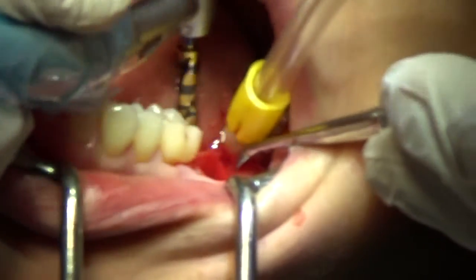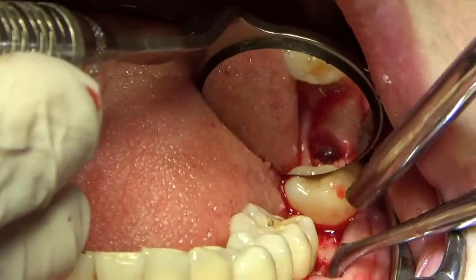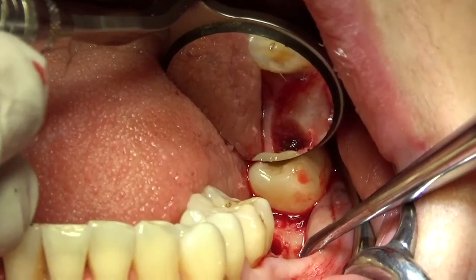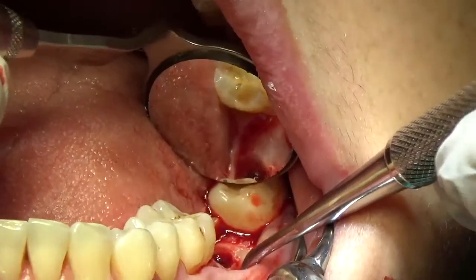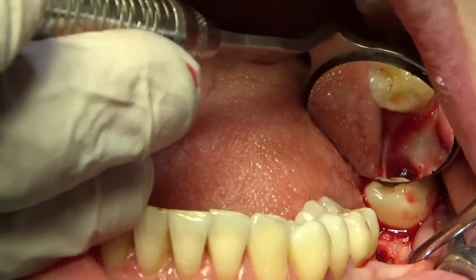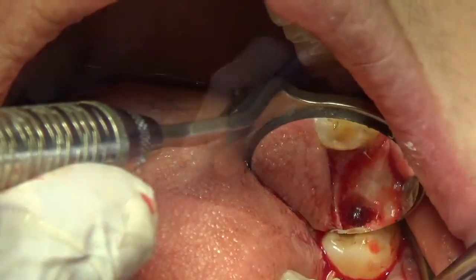Falls right in. Perfect. Great. When we're looking, if you guys can see right there, there is definitely going to be a defect on the buccal. Not huge, but there's definitely going to be a defect on the buccal because as we place that implant to depth on the palatal, it should be to depth on the buccal, or the mesial and distal as well. We're going to have a slight dehiscence. So never fear, we know what to do with that.